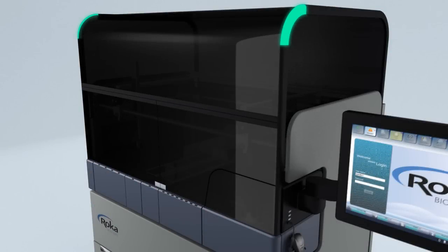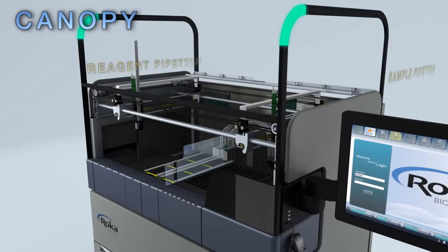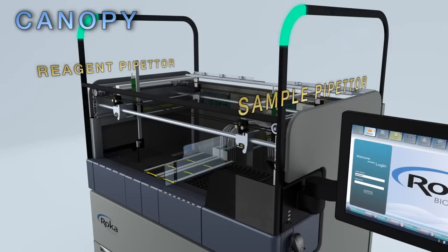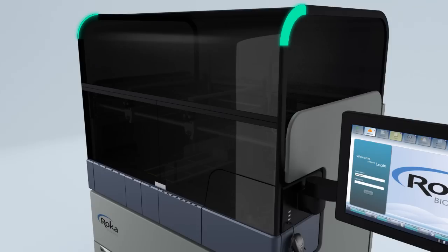The instrument is composed of four main areas. The canopy of the instrument houses the two independent state-of-the-art pipetters, allowing for greater flexibility in performing assays on the instrument.